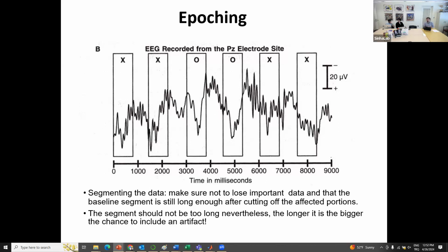So you don't know what the axis of these signals should be, should it be zero, something close to zero, or maybe way larger than zero? To be able to understand that, you can use these non-relevant windows in the time spectrum of the signal, and then you do baseline correction, meaning that you calculate the mean on these non-relevant windows and then subtract that from the relevant portion of the signal.